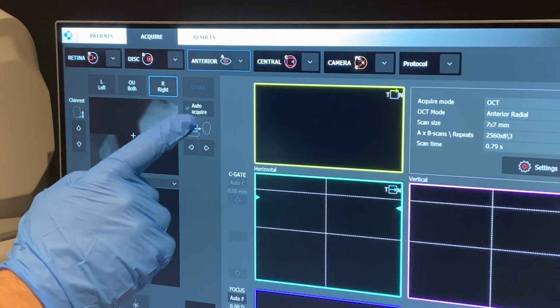I'm just going to flick between the two. So the other thing, and again, it doesn't matter if you're in single eye view or both eye view, if you double click a tomogram, you blow the window up so you get a larger picture of the retinal slice, representation of where that slice is, the red line. So again, I could roll through it with my mouse, or if I want to quickly scroll through it, I can grab the red line, scroll through.